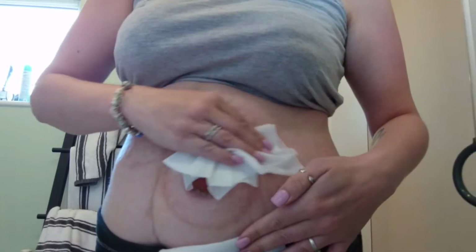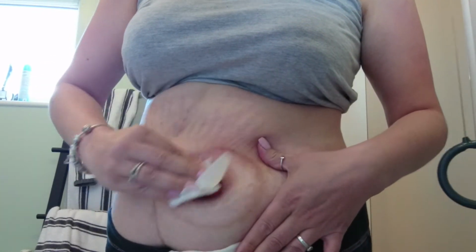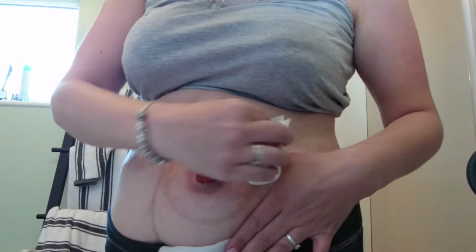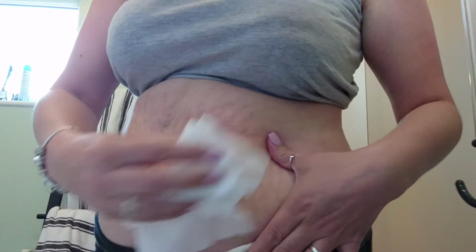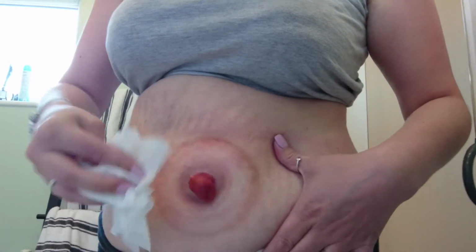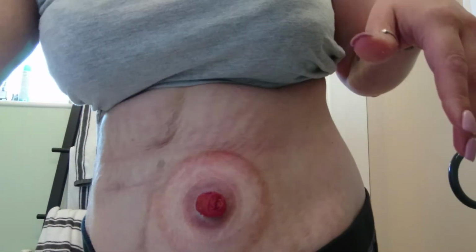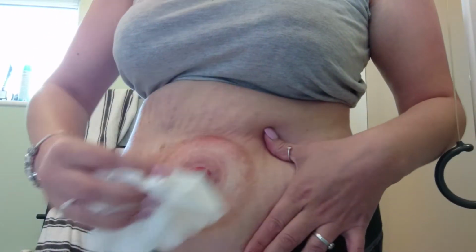So I have my sterilised wet wipes, which I clean off the site with. So give that a good old clean up. I can't wait for when I finish this, because I haven't had breakfast this morning, so I could guarantee that it wasn't going to do a Jackson Pollock on me. So give that a good old clean off. Right, so as you can see there, even with the 2 sprays, all of the adhesive, so that is including from the bag and the barrier ring, is no longer on there. So I'm just going to give that a bit of a dry wipe.